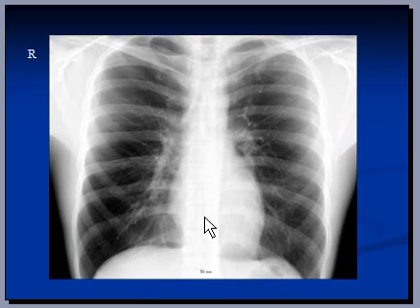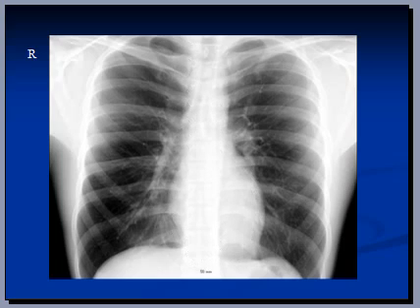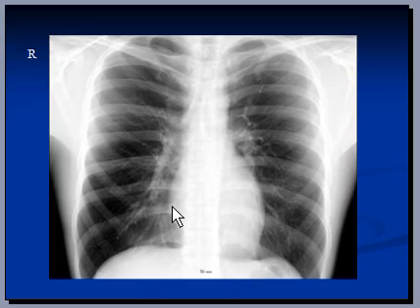Right and left heart borders are clearly visible. Right and left hemidiaphragms are clearly visible. Mediastinum is essentially normal in size and shape. Although lungs are a bit hyperinflated, they essentially look normal. Heart size is normal.